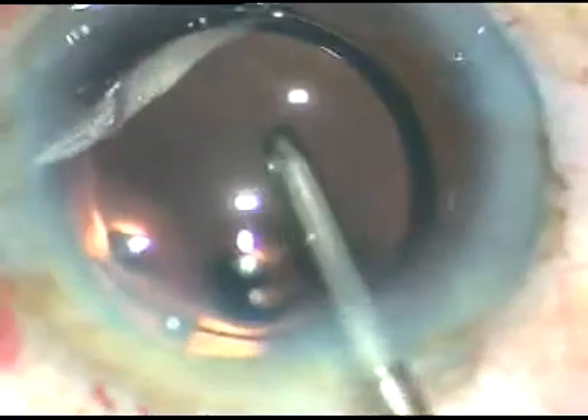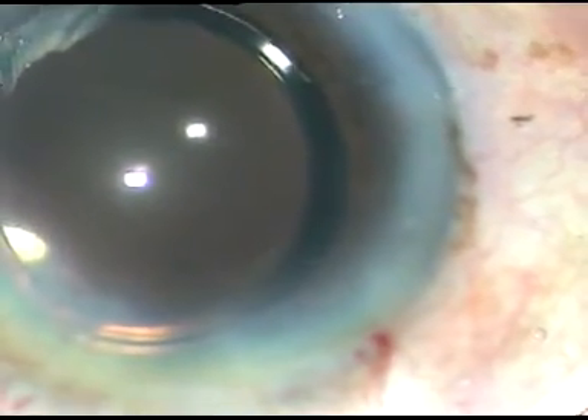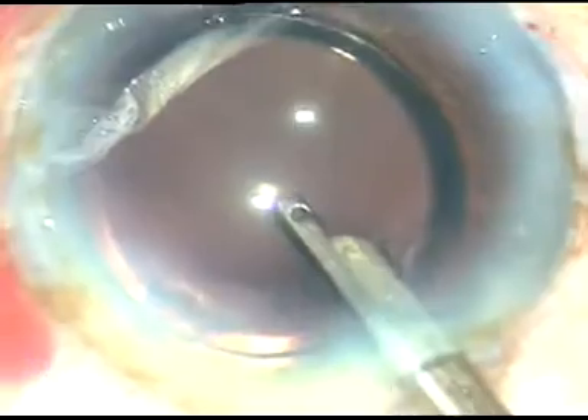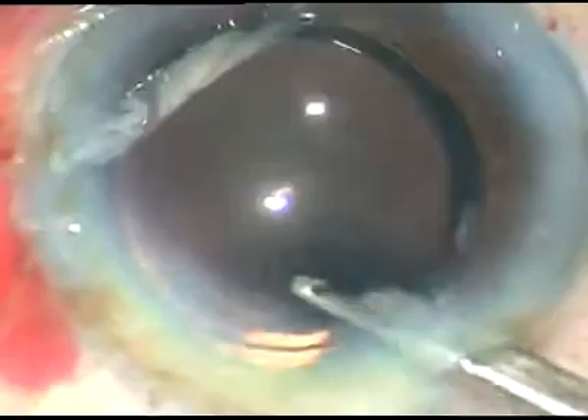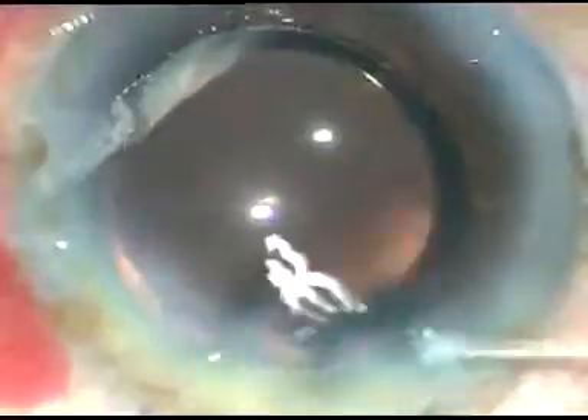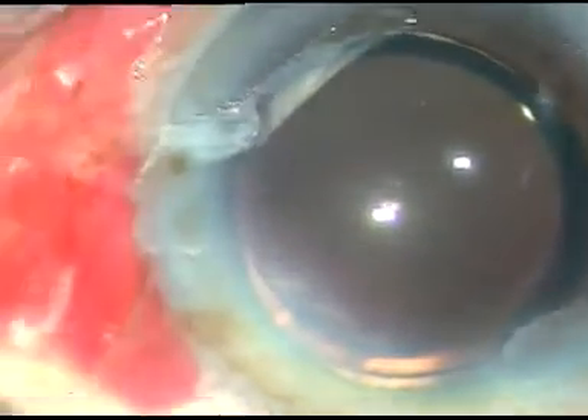Now the viscoelastic substance is thoroughly cleaned. First I used the Simcoe cannula to irrigate and aspirate the viscoelastic, then I use the irrigating probe. After thorough cleaning I hydrate the side ports and do a final anterior chamber lavage, then conclude the case. See how the anterior chamber forms and how the main wound looks — there is no wound burn. This is the magic of the Alcon system. Thank you very much for your attention. Hope this video will help you in managing your hard cataracts.